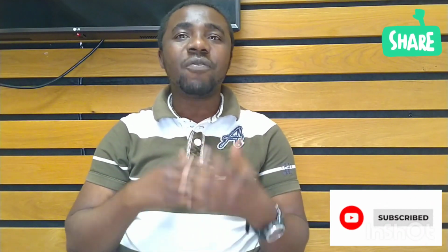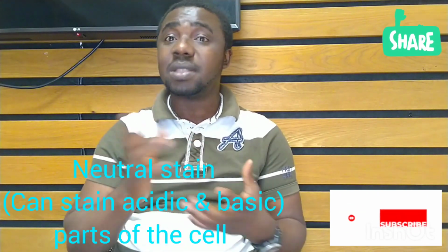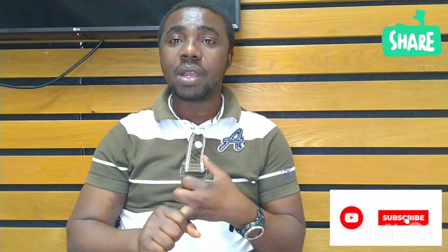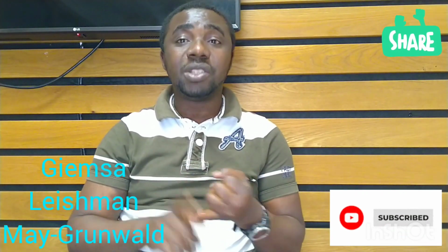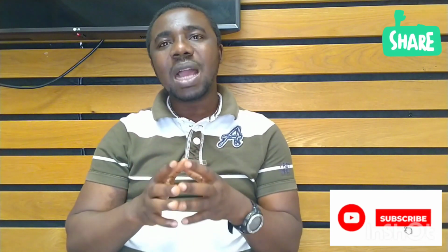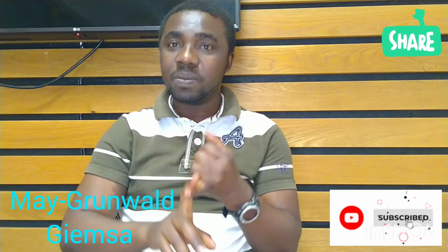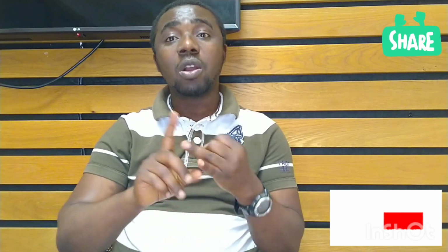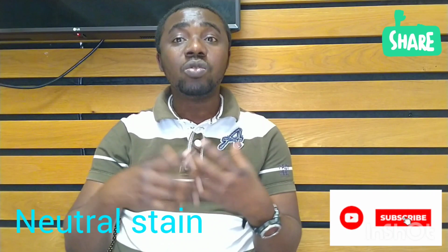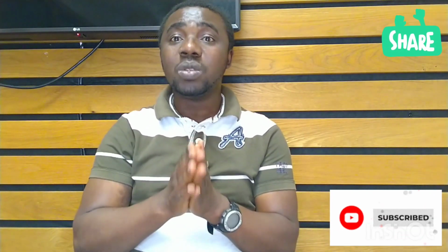So basically they use a form of Romanowsky stain. Remember that Romanowsky stains are kind of multi-stains, where they contain both the acidic dye and basic dye. Now Romanowsky stain, you can get something like Giemsa, something like Leishman, something like May-Grunwald. But when you look at the Sysmex, what the Sysmex analyzer uses is Giemsa, and it also uses May-Grunwald stain. Like I've said, these stains are neutral stains where they contain both the acidic dye and also the basic dye. But these are the two stains that are commonly used.